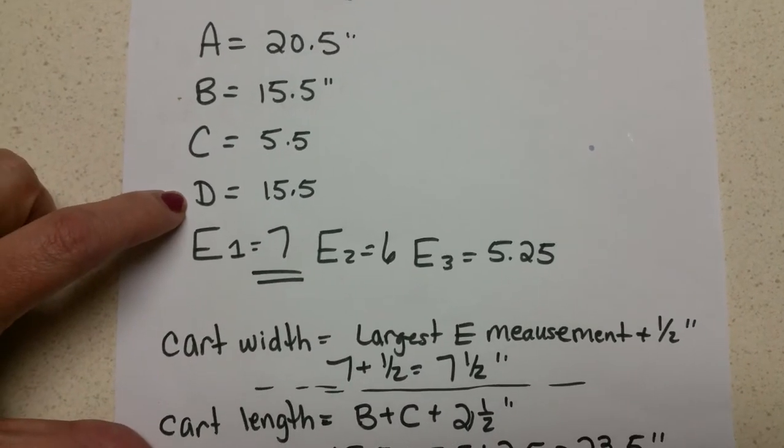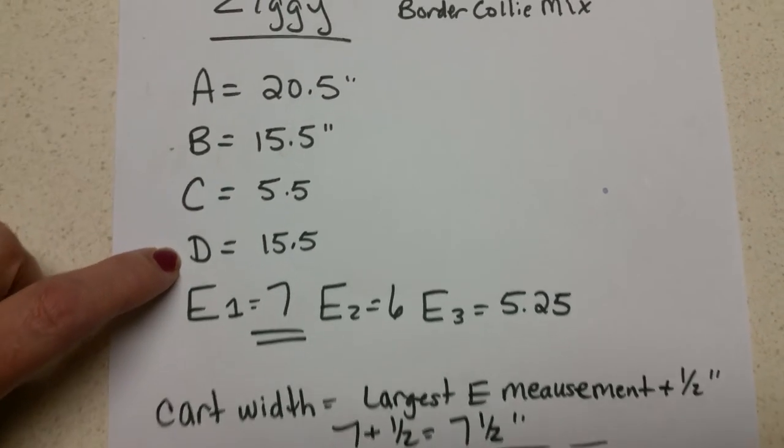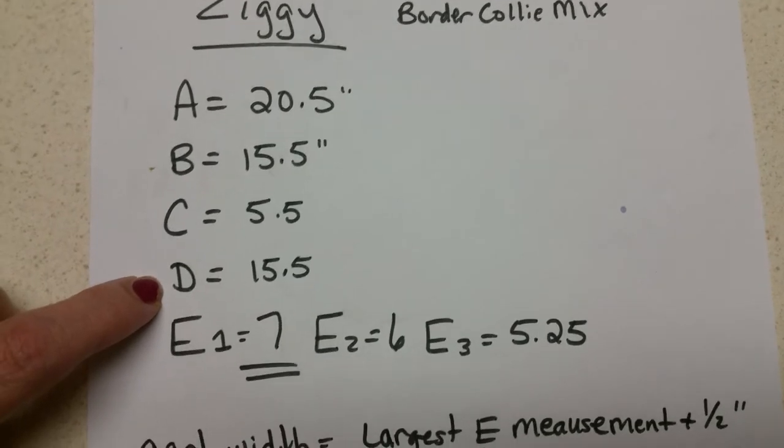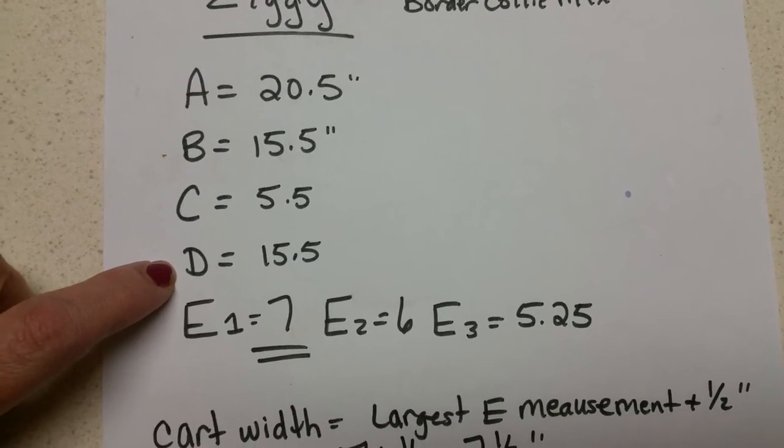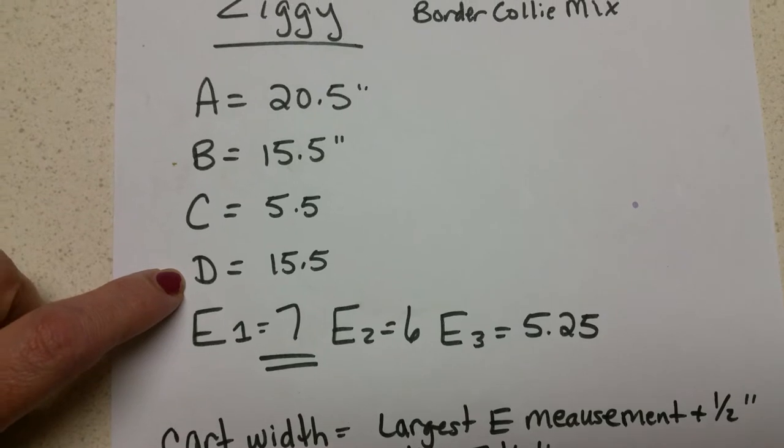D tells us how tall he is in the groin. So that's from the ground straight up in between the dog's legs until you feel skin.